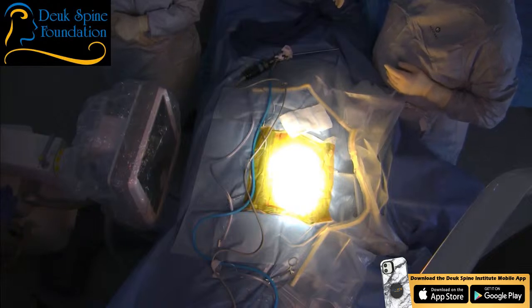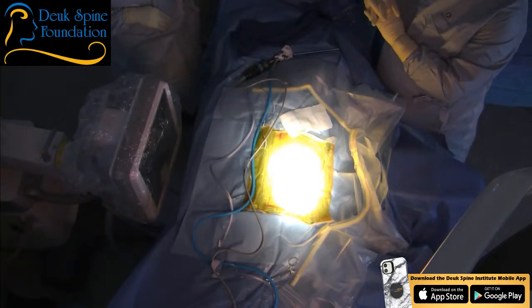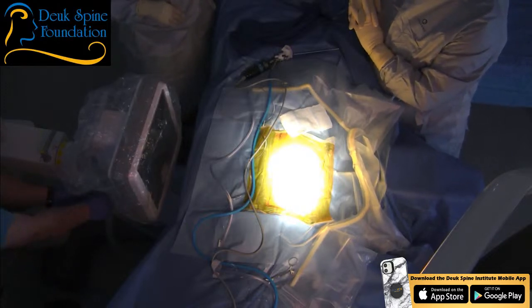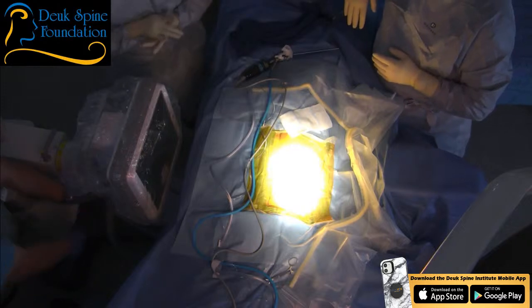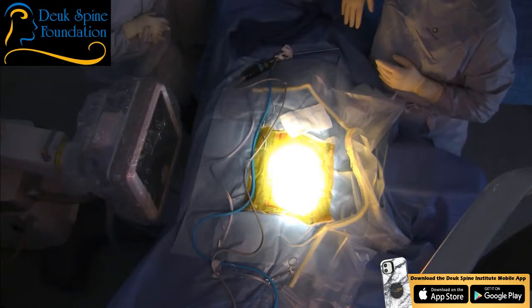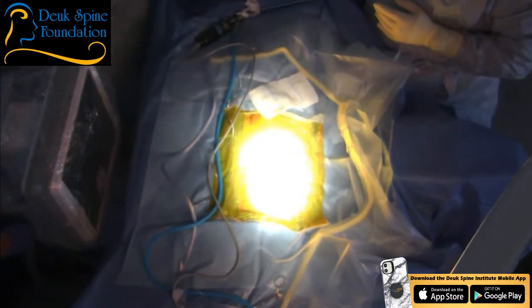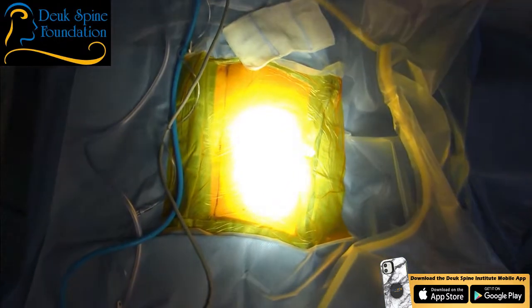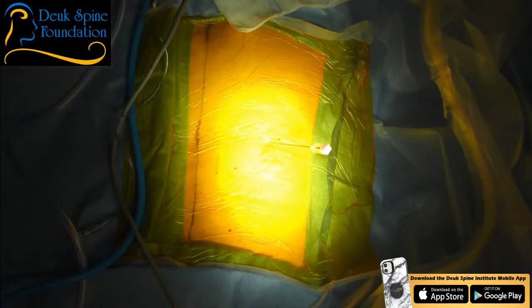So this surgery we're doing requires something called navigation. Navigation in surgery means getting to a place that you need to go to. So you're navigating, just like if you're navigating a ship around islands or rocks or a coral reef, so you don't... that's better.